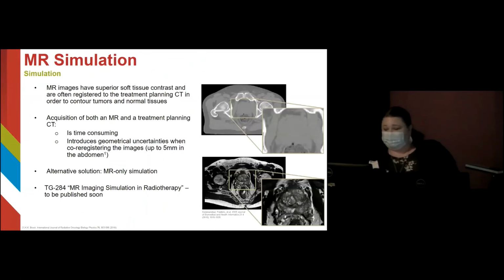All right, so as we all know, MR images have superior soft tissue contrast, and they're often registered to the treatment planning CT in order to contour your target and your normal tissues. An alternative workflow, though, is to use an MR-only simulation.